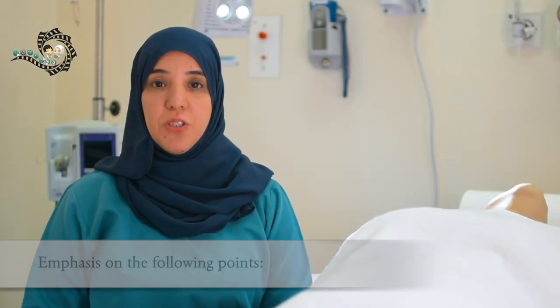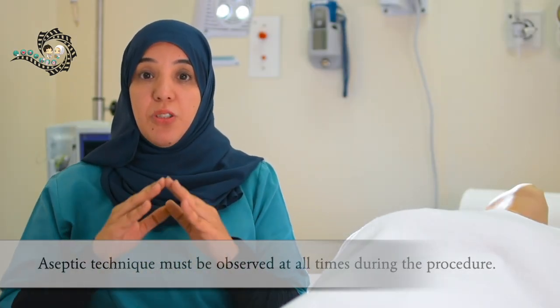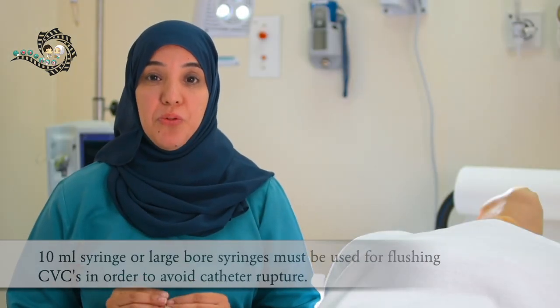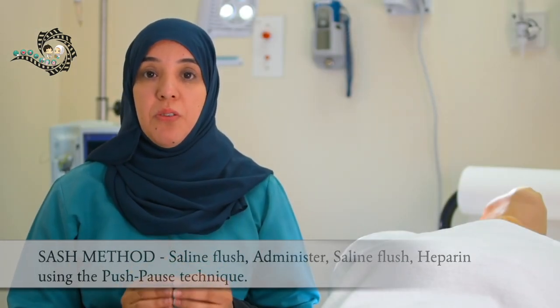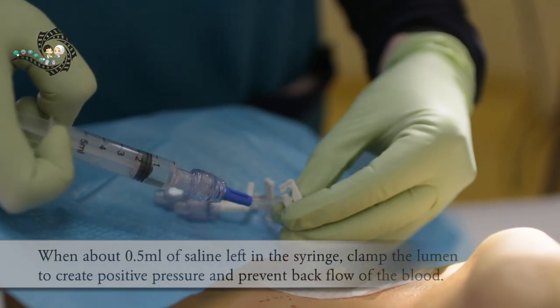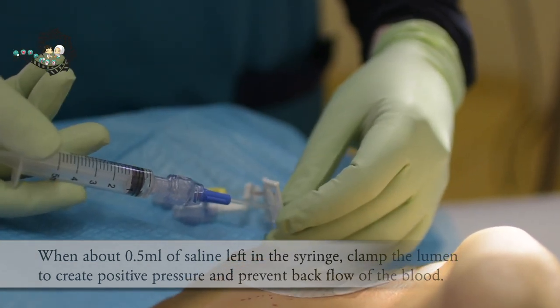Before ending this video, I would like to emphasize the following points. Aseptic technique must be observed at all times during the procedure. A 10 ml syringe must be used for flushing the CVC to avoid rupture. Flushing must be done with the SASH method with push-pause technique. When about 0.5 ml of the saline is left in the syringe, clamp the lumen to create positive pressure and to prevent backflow of the blood.